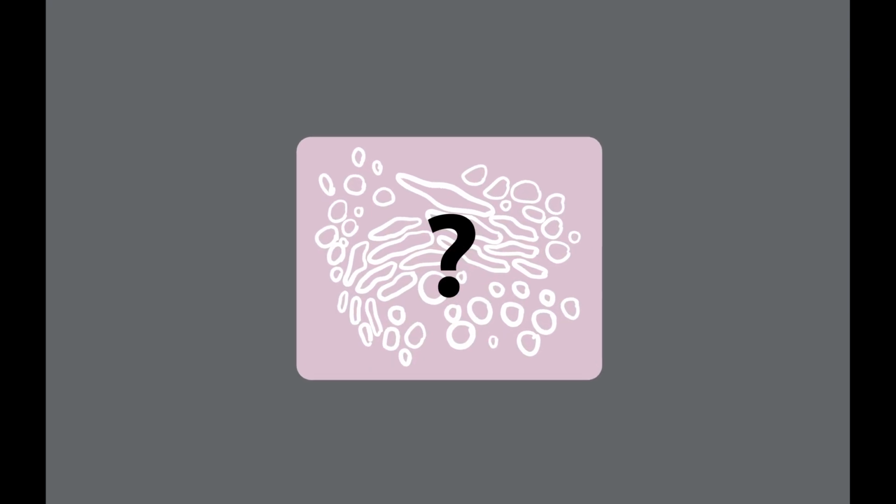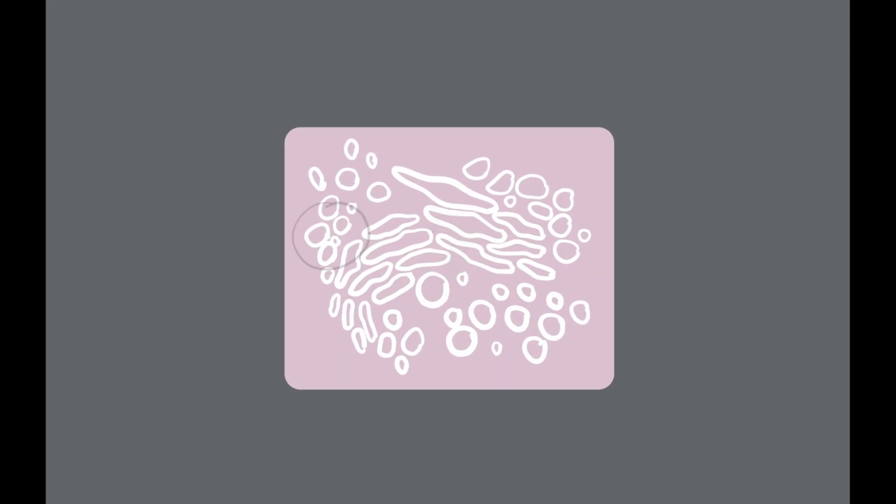When considering today's aging population and the increased prevalence of chronic disease, the desire for non-invasive diagnostic tools is obvious. Even though there are promising imaging modalities available today, they cannot accurately capture microstructural changes in tissues. Consequently, they are not specific enough to provide necessary information regarding distinct cell density, shape, and orientation to truly live up to their promise.